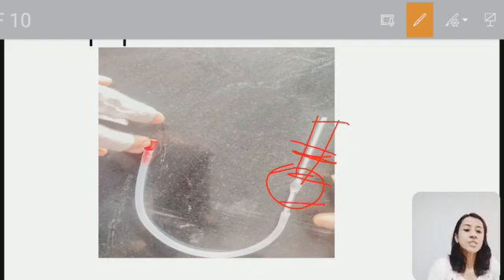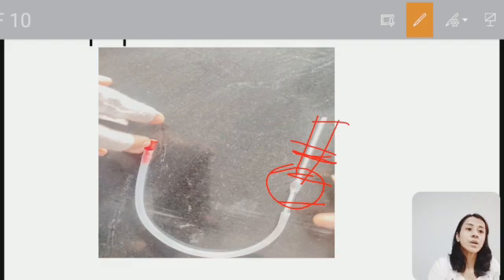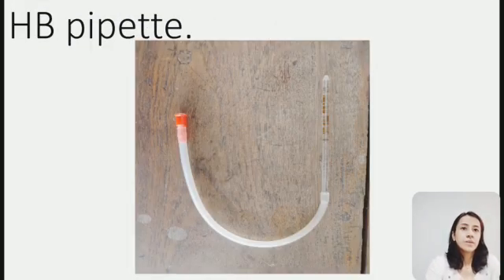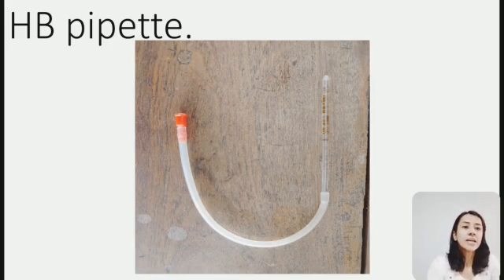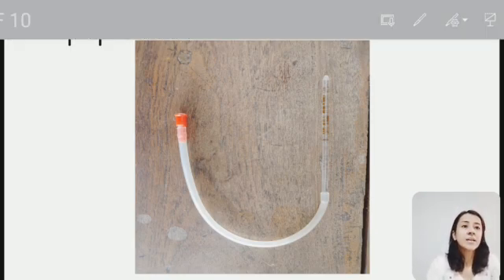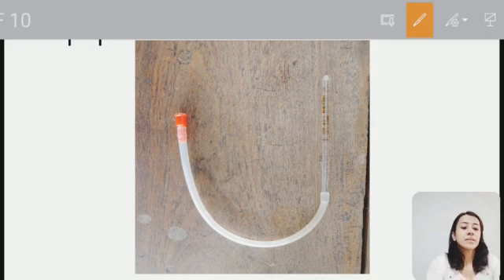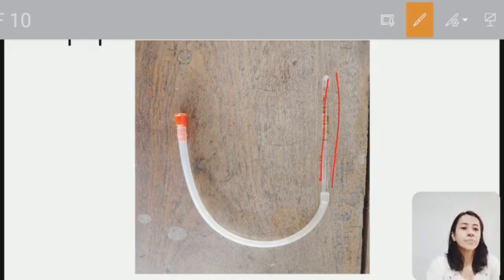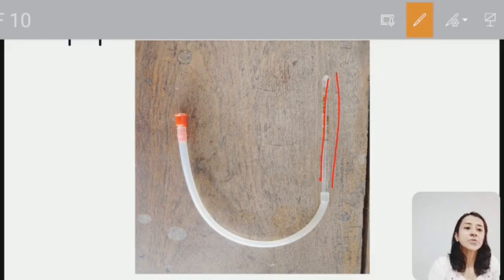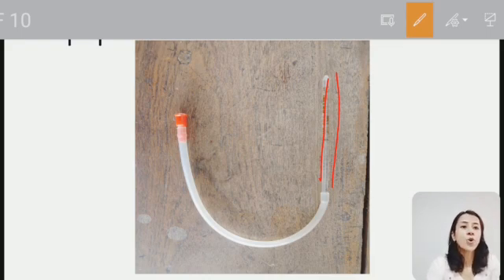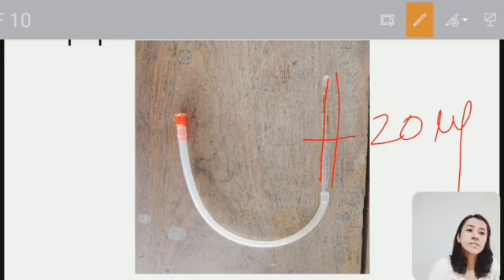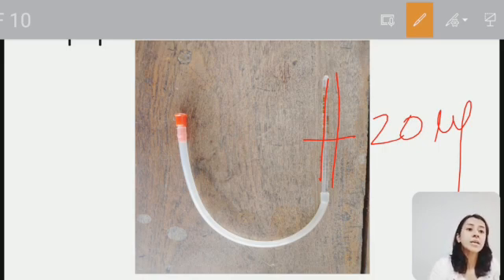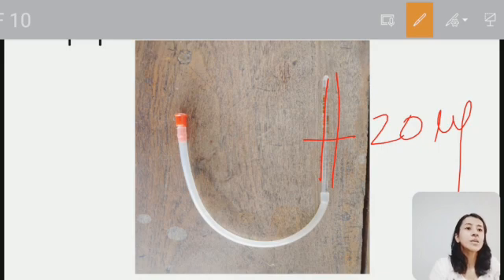The next instrument is the hemoglobin pipette. This hemoglobin pipette has a capillary tube but there is no bulb, just a capillary. It has only one marking which is 20 microliters. The use of the hemoglobin pipette is to take blood when we are performing hemoglobin estimation by Sahli's acid hematin method.